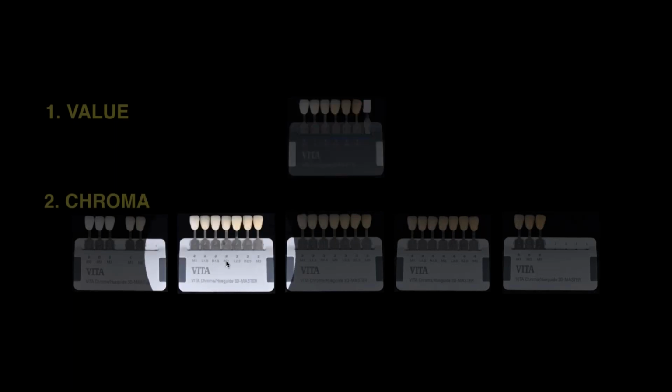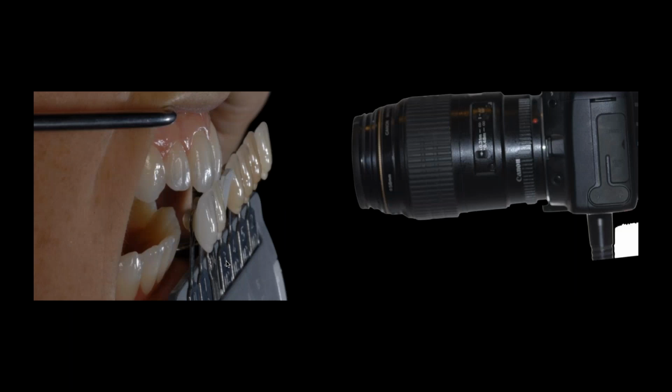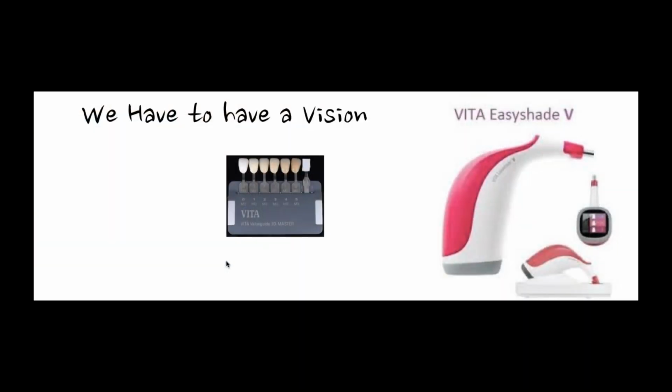Step 1, step 2, life is much simpler and much easier to communicate the information I'm looking for from the doctor. The other thing I do is use some tools. So I am using an EasyShade here. I want to be honest about how I use the EasyShade. I think the important part is, does the EasyShade give me color information? It does. But I tend to use it a little bit differently.